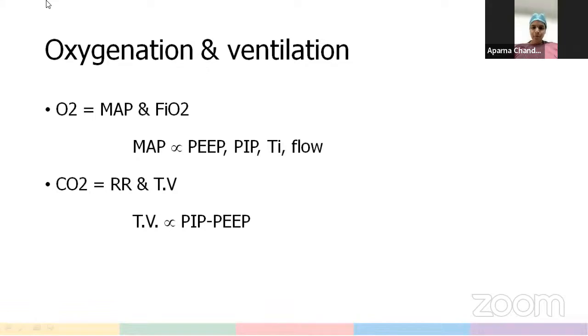So now I hope you would be able to see the ventilator in some time, and we can actually demonstrate the knobs and various parameters. Are you able to see the ventilator now?